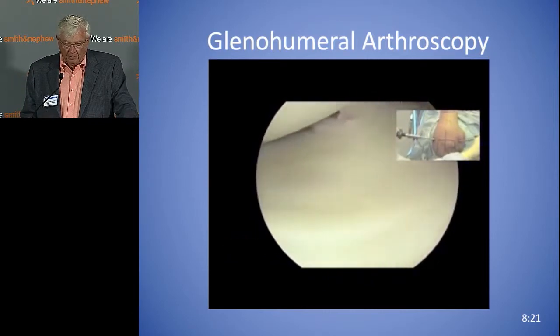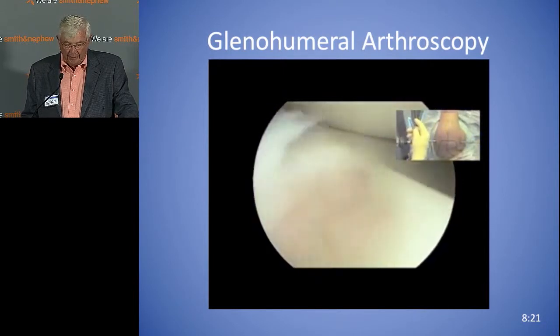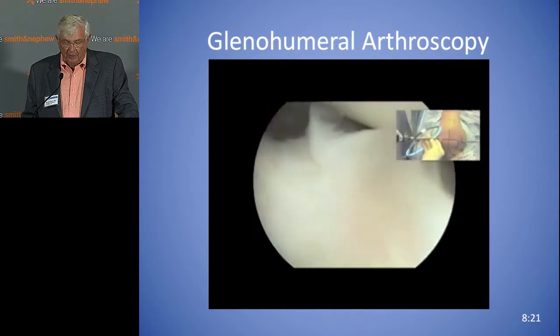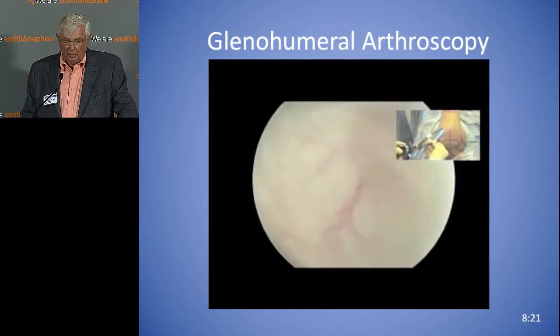Now you swing around and look at the posterior labrum. Usually I use two hands on the scope so it doesn't get squished out of the joint. And you can evaluate posterior inferiorly — especially in throwers — with the so-called HAGL lesion down in that area.